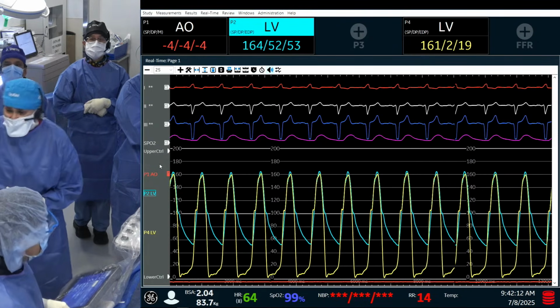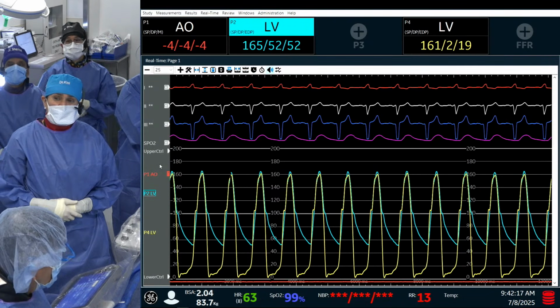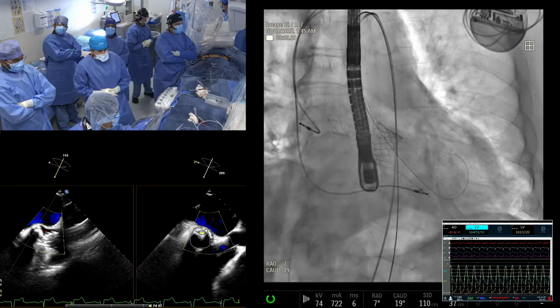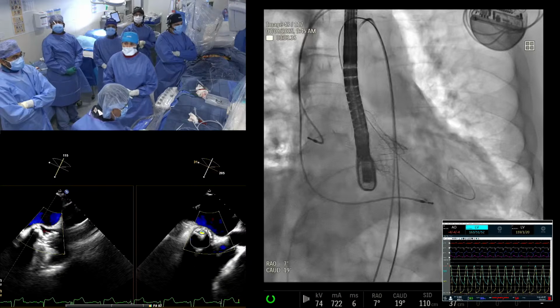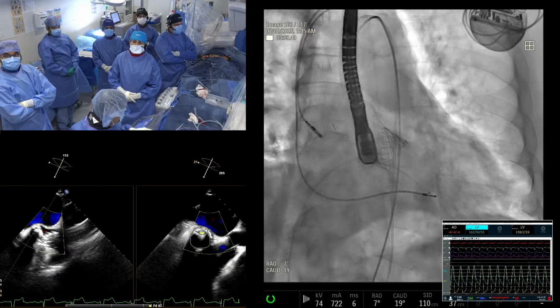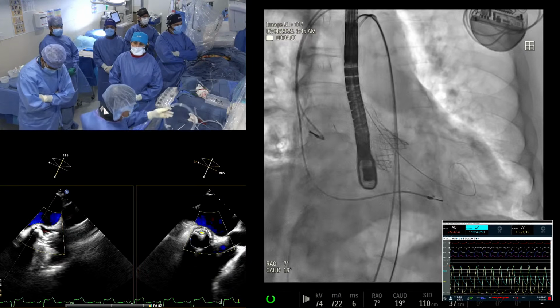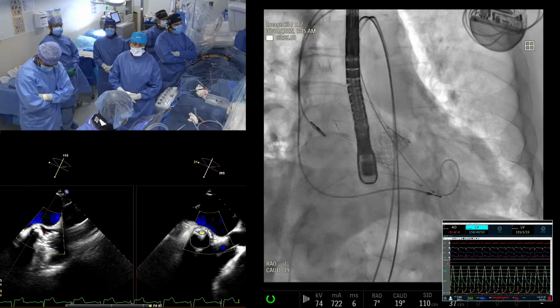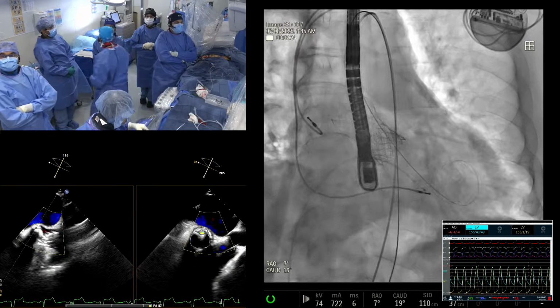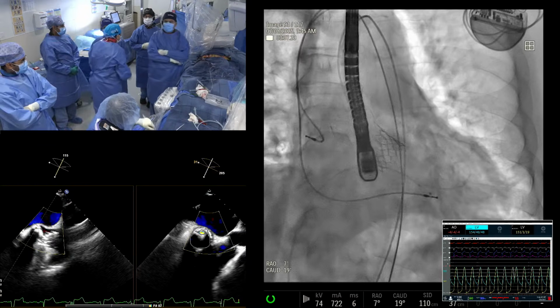Can you show echo and hemo at the same time in fluoro? All three screens, please. Yeah, 6.7, 0.4 divided by 6.7. Are you using mental math or a calculator? Calculator. The calculator gives you 5%. So you went from 25% down to 5%.